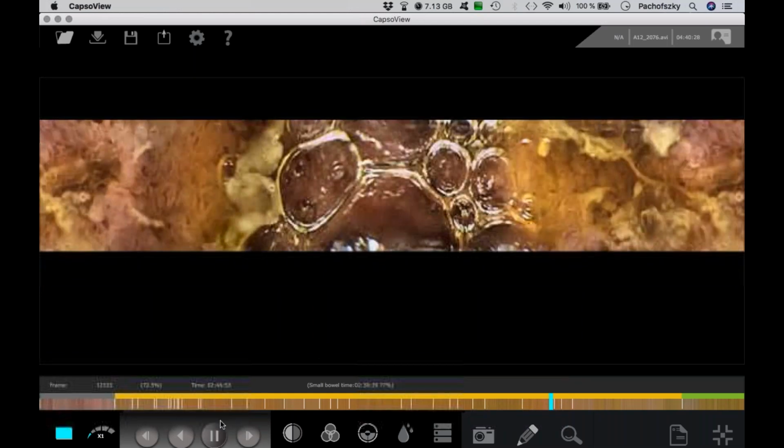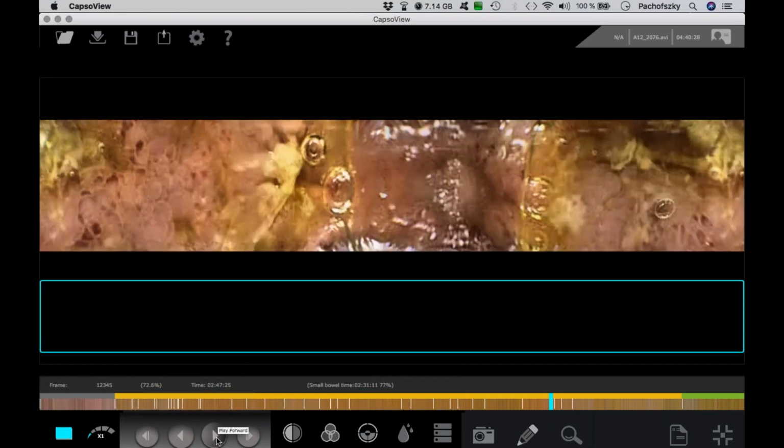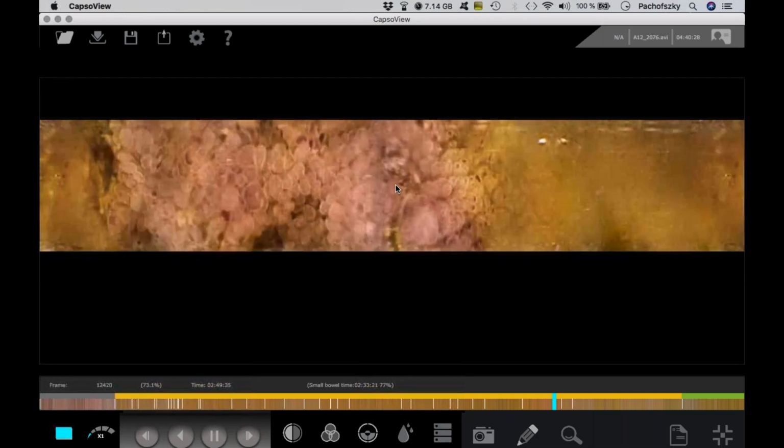And if you look in this area here, you can see really big fat villi, a lot of inflammation, some intramucosal bleeding as reaction of the inflammation, ulcerations everywhere, and that's a Crohn's disease, a young male patient with the first diagnosed Crohn's disease in the small bowel.